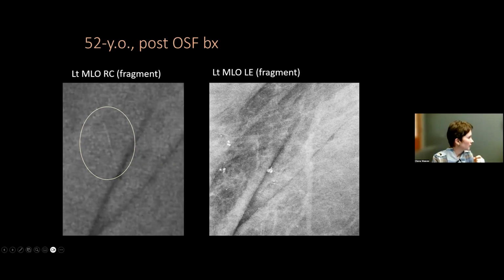But the point is that the calcifications, for example, don't show as white little dots. You see that there are calcifications right here, and we don't see them as white dots. Really, the recombined images of CEM don't usually have that good of a resolution to demonstrate such small findings. So if you have this dotted white appearance, it's possible that this is an artifact, specifically a contrast splash artifact. And if you just wipe the surfaces, you should be able to get rid of it. And if not, then you need to contact your vendor.